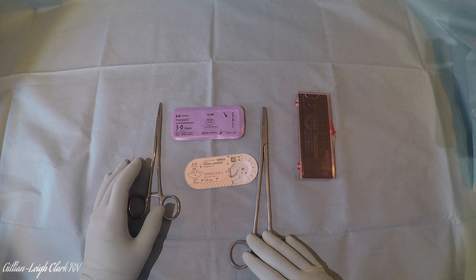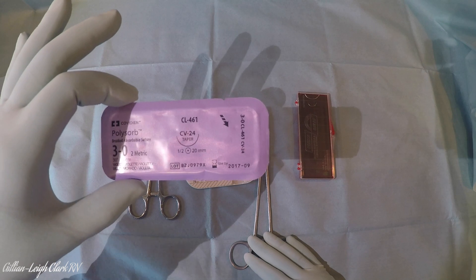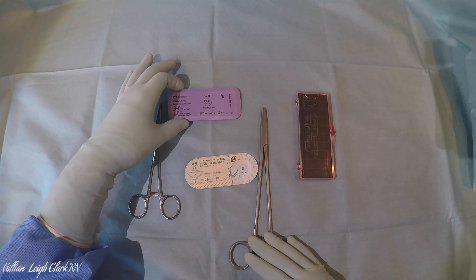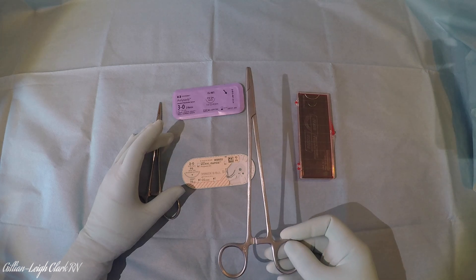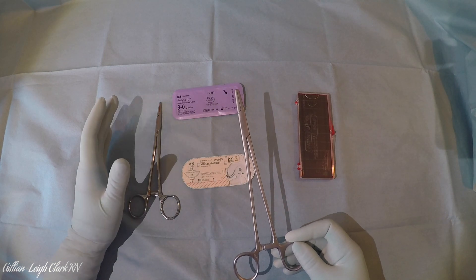Some sutures come in a packet ready to go and some of them come in a second packet that needs to be opened. It doesn't matter - it's all the same idea. When you put it on, they're always going to be coming in the packet right-handed; it's pretty much a standard, and since the instruments are right-handed that's how you would go. If you need to change it to left-handed you can do so later.